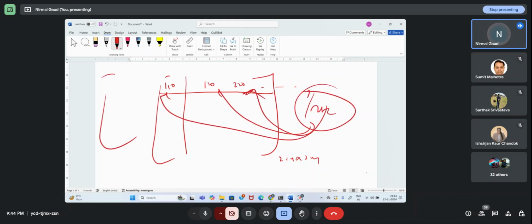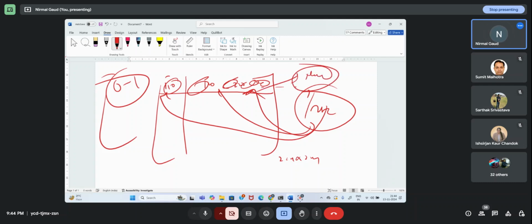So it will now become 0 to 1. Every value in an image will now convert between 0 to 1. This is called normalization. You're scaling your data, scaled to 0 to 1.